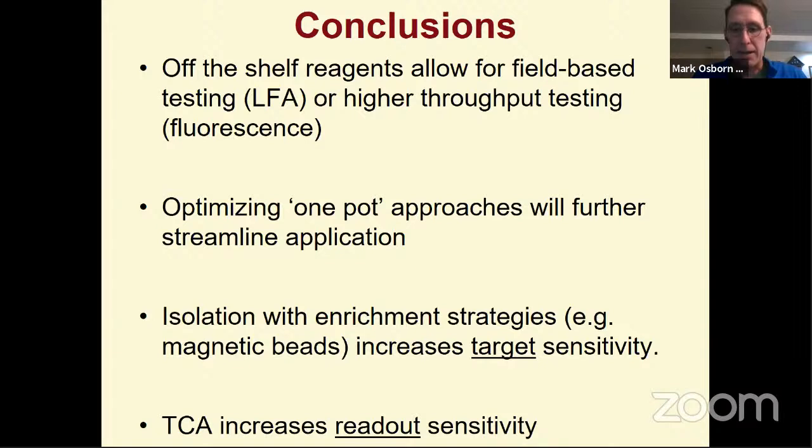But again, we built this with every reagent being able to be commercially obtained, which we hope will promote expansive diagnostics and make it more amenable for further refinements and improvements.